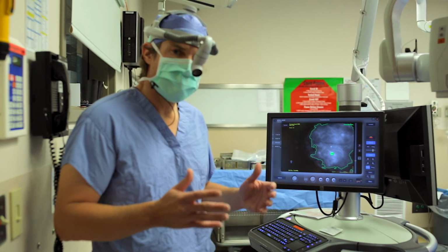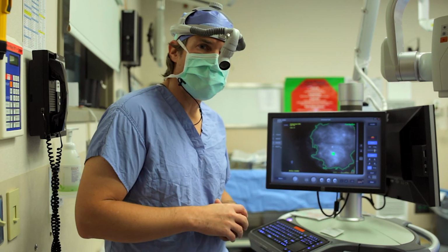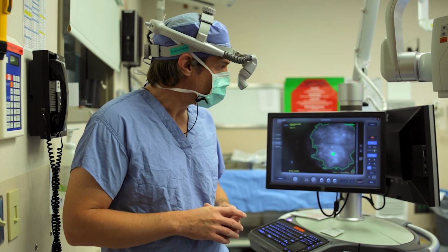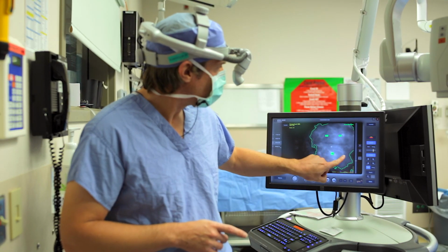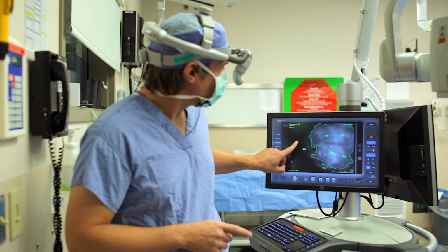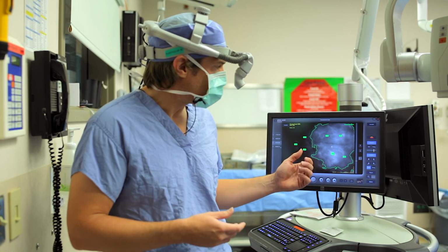Some of the work that's been done shows that areas of skin that are perfused less than 20% are going to struggle postoperatively. Now, I can tap numbers around the screen, and it'll tell me what these relative values are.